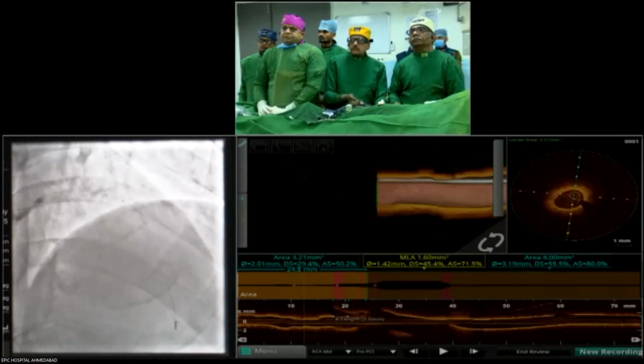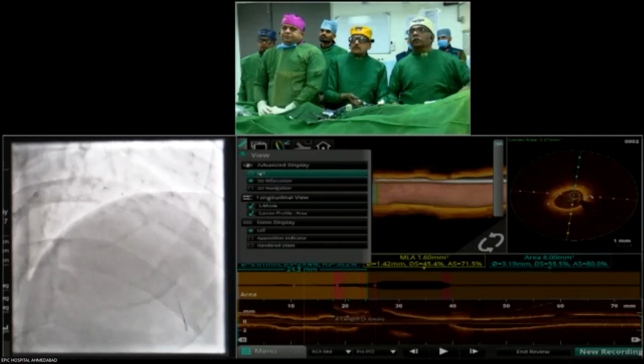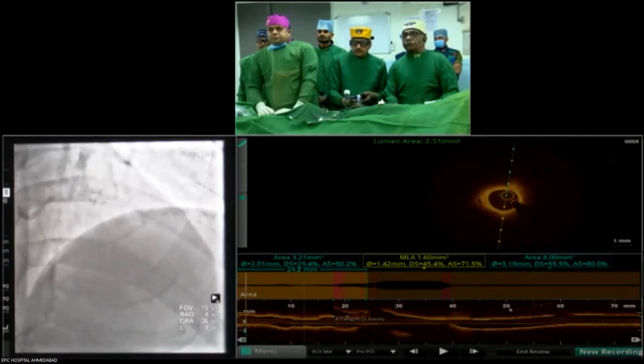Okay, Dr. Anoop Gupta, are you going to do all that, or have you started already? Oh, we are going to dilate now with the balloon. Okay, so we'll come back to you in about 10 minutes. That's fine. Thank you. Give a new Go invite.